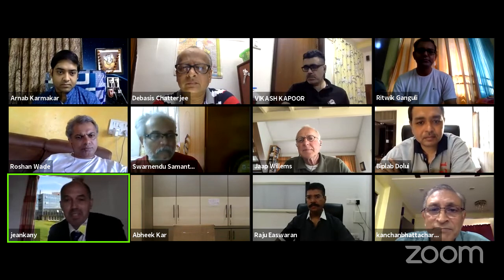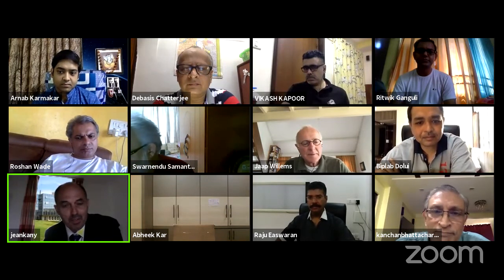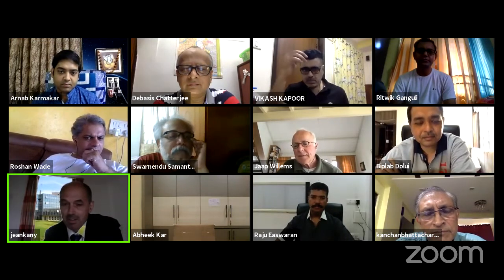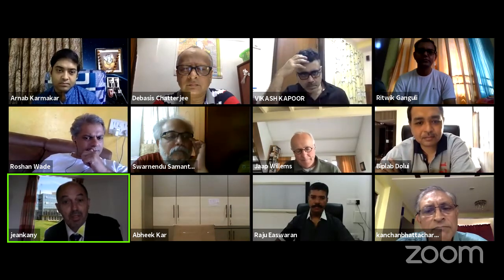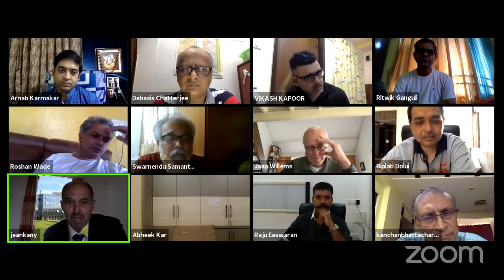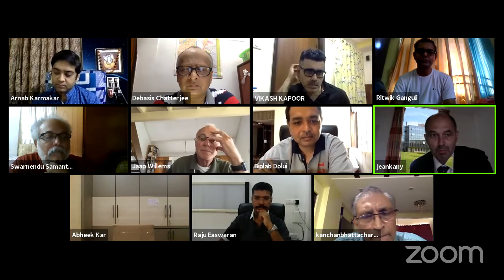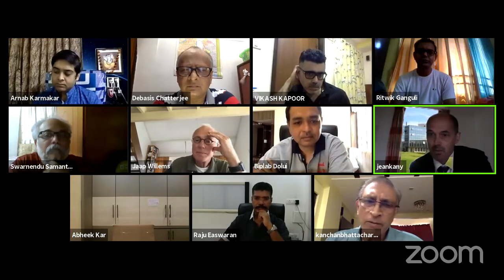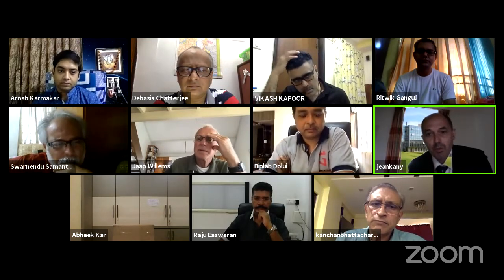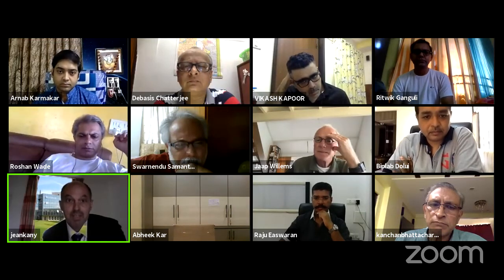I prefer the CT scan. I don't like the MRI, sorry to disagree with my friends. I prefer CT scan because, as you said, it's better to analyze the bone loss, first of all, and you will see in my presentation, my decision-making flow is based on the CT scan and the bone loss. The second point is I prefer the CT scan because you have more slides, about 200, 300 slides, and in comparison with the MRI, you just have 16 slides.